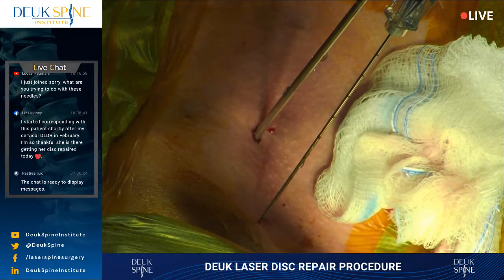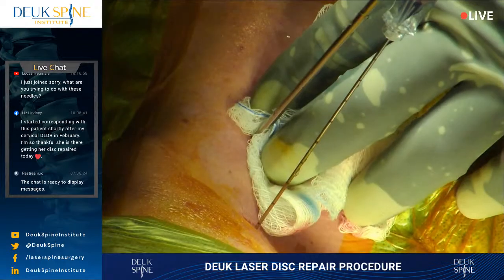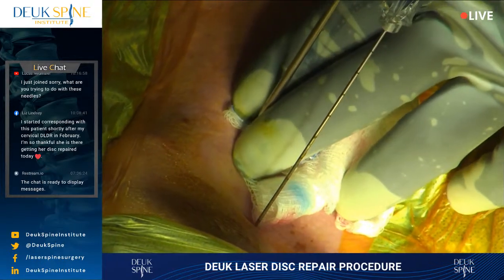Shot. Let's make sure everything's going well, which it is, and we're on our way down with our dilator. I give it a little twist as I go so it doesn't grab tissue on the side, and pull. Some of what you're seeing right now is called the access or exposure.